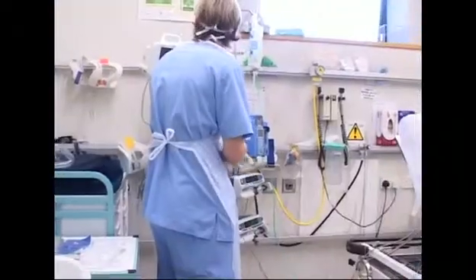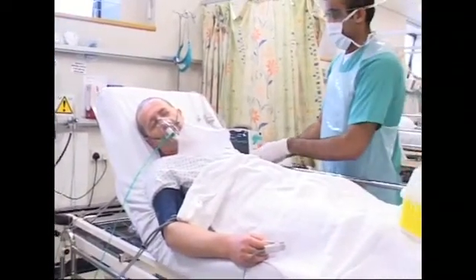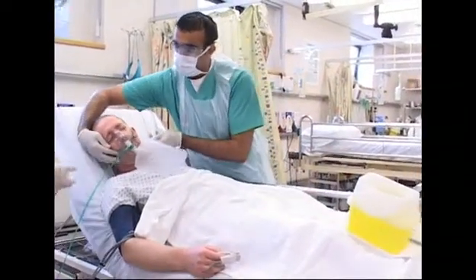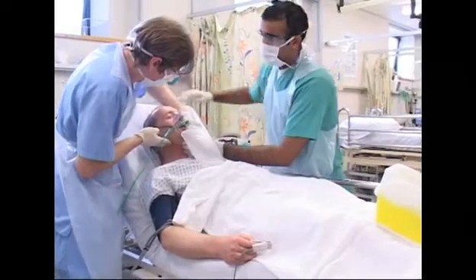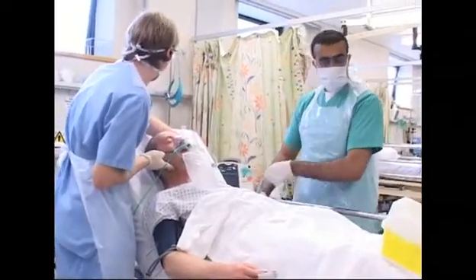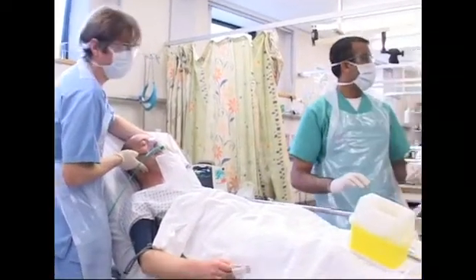Here are some examples of airway obstruction. This patient has just developed partial airway obstruction and the nurse noticed that the patient's breathing was insufficient. The cause of this was a fall in conscious level. Nursing staff quickly open up the airway by tilting the head, lifting the chin and thrusting the jaw forwards, at the same time as giving oxygen.